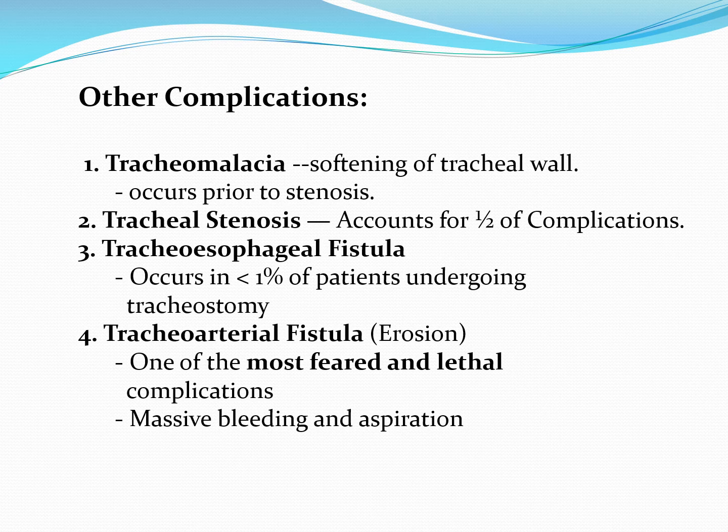The only real hope for a patient like that is if you can get the cuff of the tube to where the erosion is and hold it there. You're not going to be able to see. The bleeding will slow down immensely if you can do that, and then get the patient to the OR and just not moving that tube at all. But in all likelihood, the patient will pass away because of that.